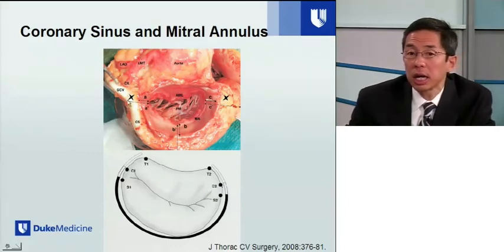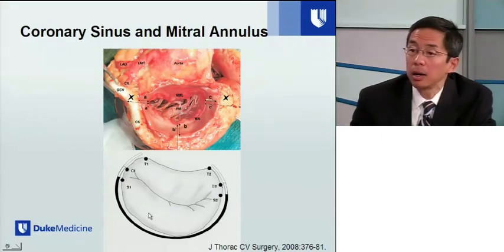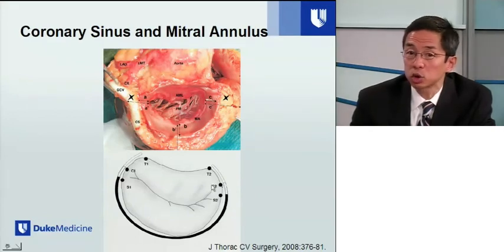Finally, the coronary sinus really mimics here in black the anatomy of the posterior leaflet, but does not extend all the way to the trigones here as an annular ring would to provide the degree of anterior-posterior shortening that one would expect or hope to get from a surgical ring. Our surgical colleagues will tell us the importance of this shortening from trigone to trigone so that the orifice area and the anterior-posterior diameter are shortened to reduce mitral regurgitation.